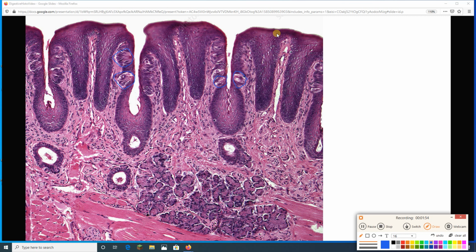Now, do note that most of the papilla, like right here for example, is a solid, protective, stratified squamous epithelial tissue. Forgive me if I don't write out that whole thing. Okay, what else do we see here?